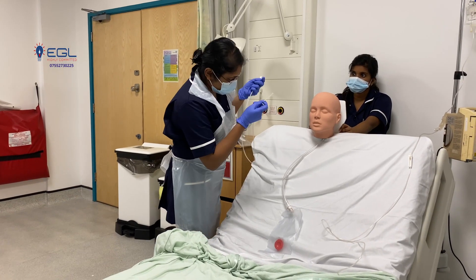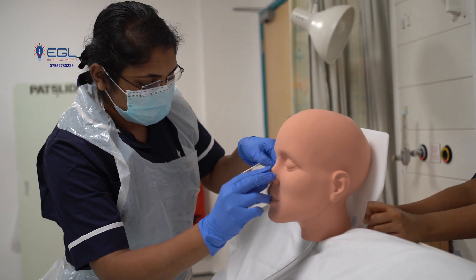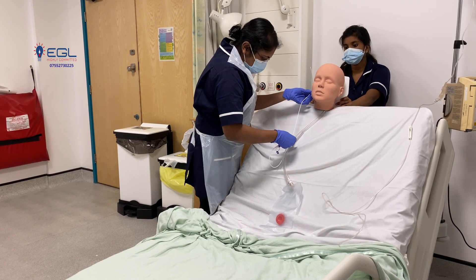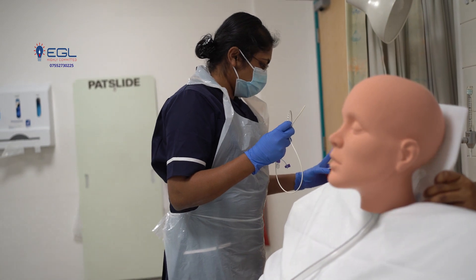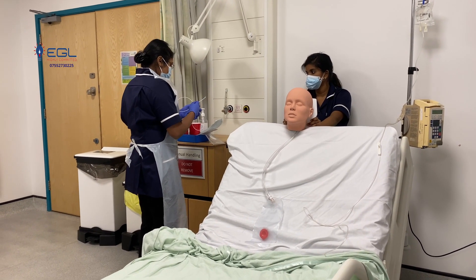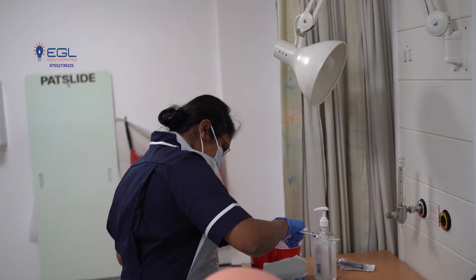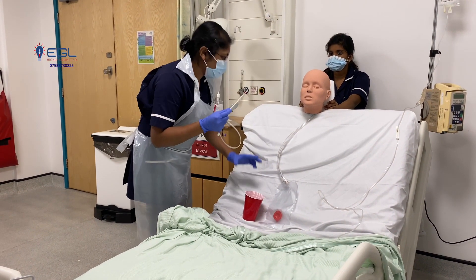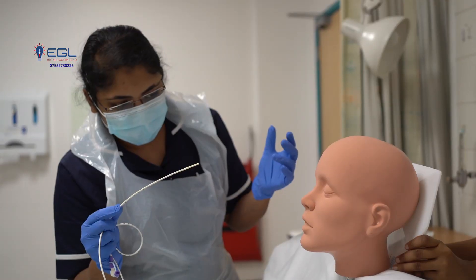We are going to measure it. The measurement is from the nose to the earlobe, and from the earlobe to the xiphisternum. The measurement is 43 cm. I am going to lubricate the tube by inserting 10 to 15 cm into the warm water. I am keeping a towel here. I am going to insert the tube — while I am inserting, you need to swallow. Is that okay? Yes.